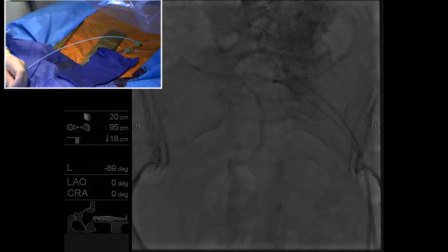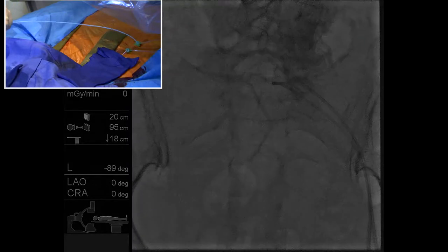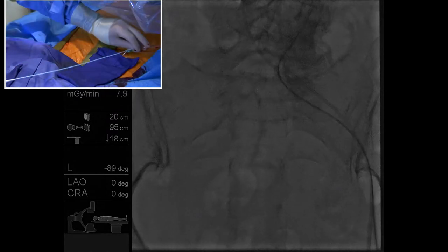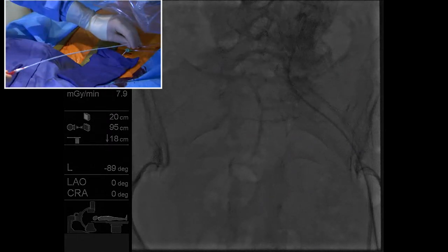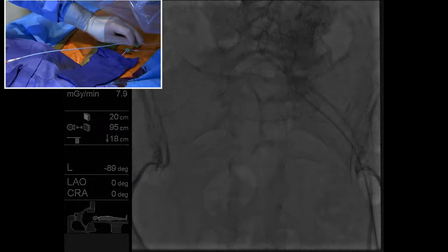So we use basically a glide wire, which is a hydrophilically coated wire that has a pre-made 45 degree bend on it, and the body of the wire is fairly soft so that we can manipulate it. And we're going to do this to hook the other side. Should be right around here.